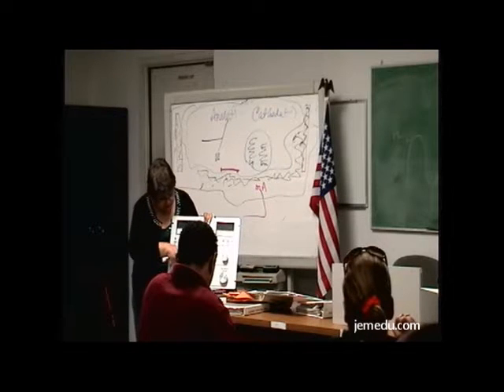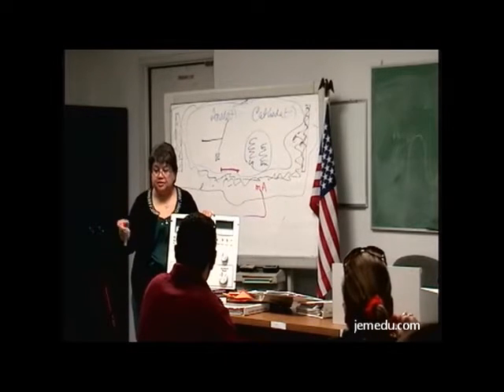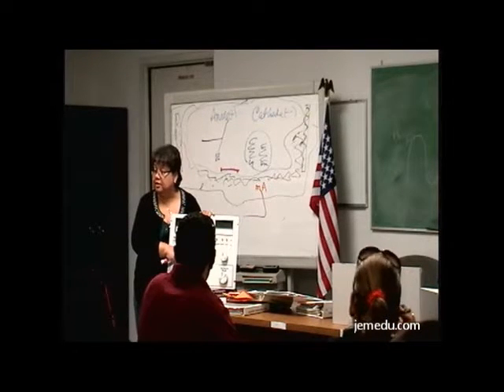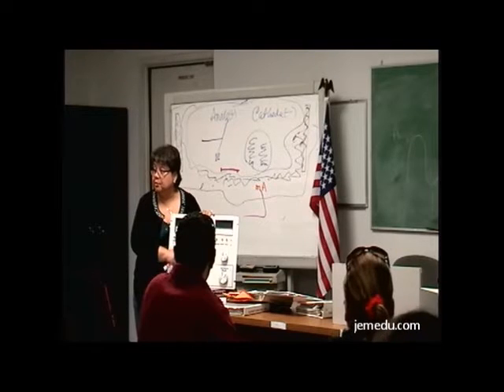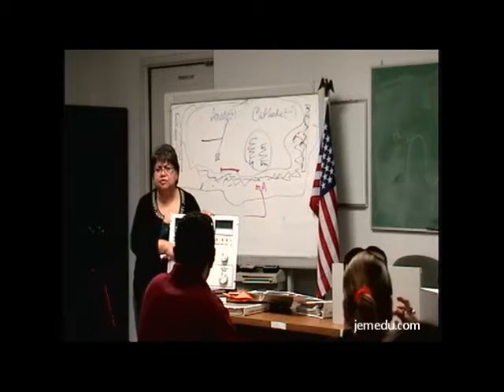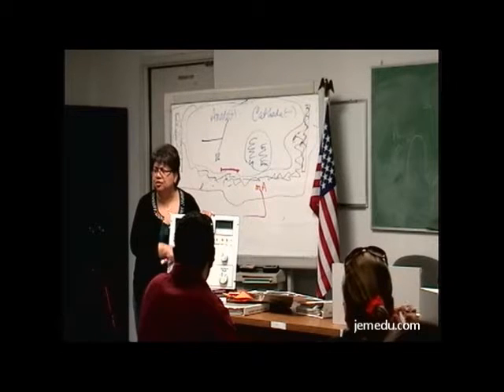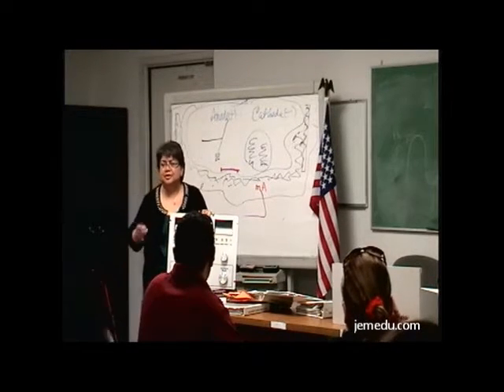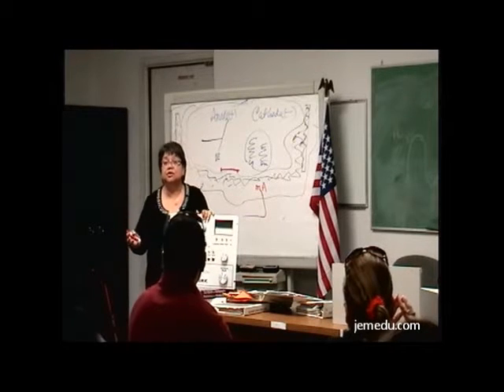So why do I select one and another? We did say, yes, it has to do with heat. The higher the number I select, the more heat I'm going to get, and therefore the more electrons I'm going to get. But what's the determining factor of which mA station I choose? The size of the patient, not necessarily the patient, but the area that we're going to X-ray.